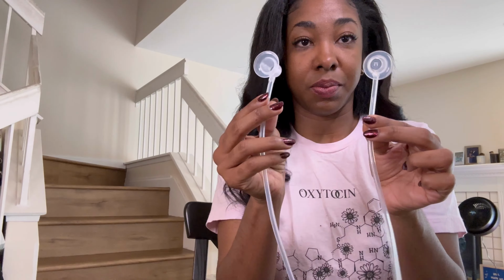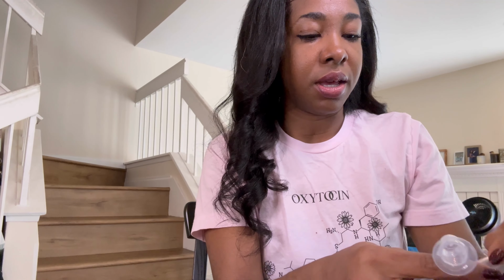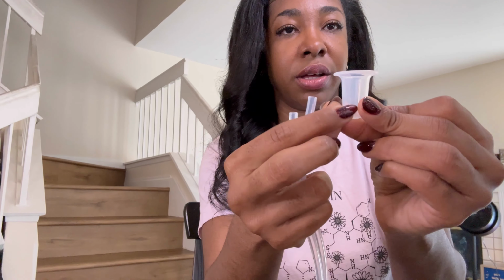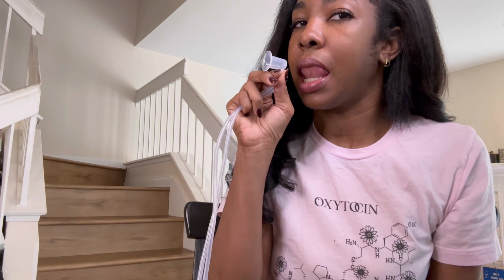Okay, but it comes with your little suction cups. These are the medium, the middle size. It has the letter on there to indicate what size it is. These will come unattached, because you'll need to find which size works best for you. They're kind of like a little bell shape, or a little speakerphone. We have our whole unit attached. We have these tubes, we have these cups, and we're going to find which size works best for you.